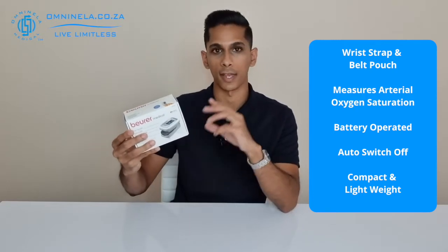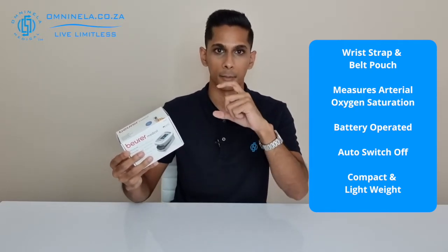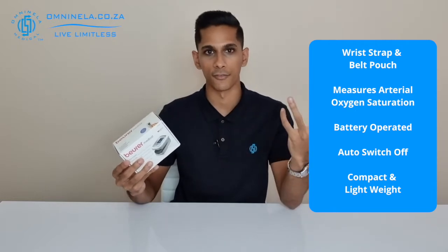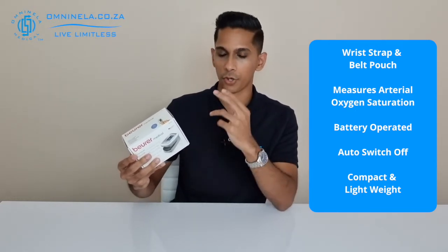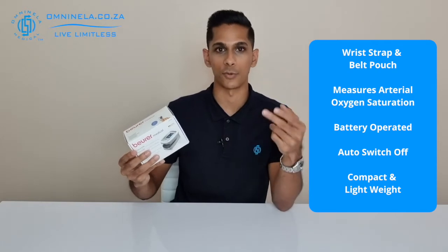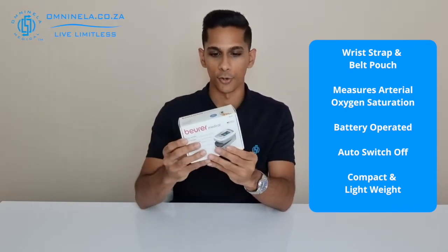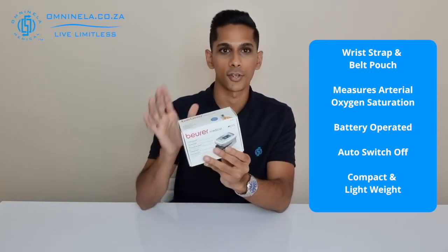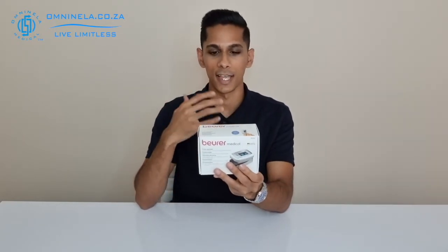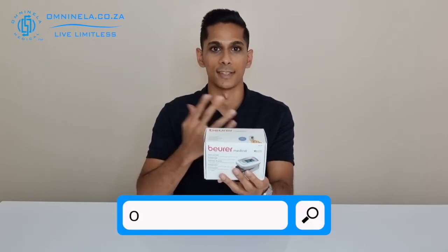We have a strap included along with a pouch that has a belt buckle loop on it — very convenient if you are someone that needs to carry it on the go. It's also got batteries; it will be powered by two triple-A batteries. It's also got a five-year guarantee, so if there are any manufacturing defects during those five years, you can head back to us and we'll be able to assist you.